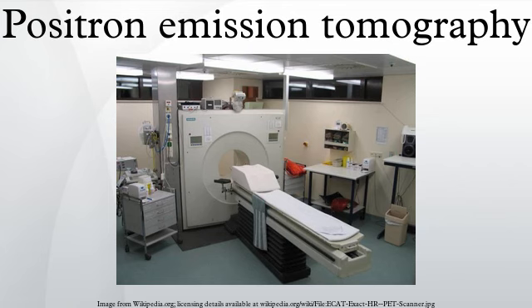PET scanning does this using radio-labeled molecular probes that have different rates of uptake depending on the type and function of tissue involved. Changing of regional blood flow in various anatomic structures can be visualized and relatively quantified with a PET scan. PET imaging is best performed using a dedicated PET scanner.